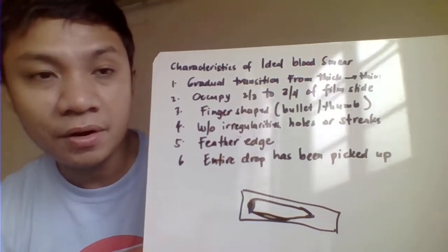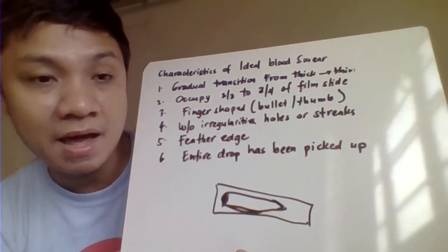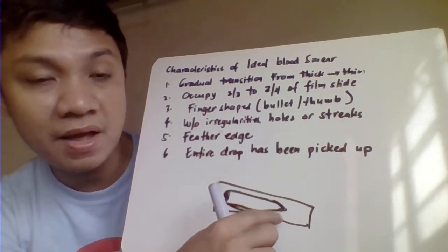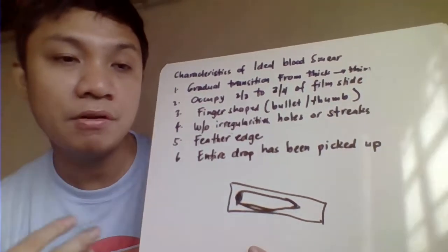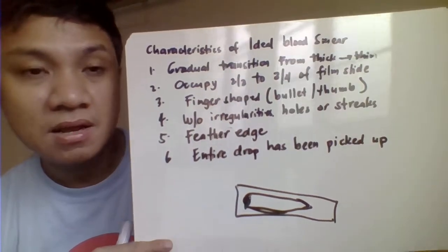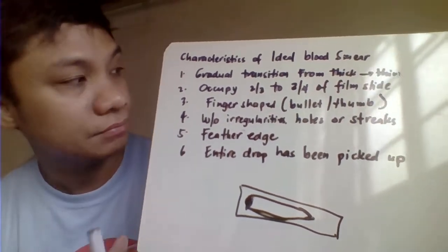When you are doing your differential count for identification of your different WBC, classifying them to different WBC, you start with the thin area in the feathery edge. So dapat may gradual transition from thick to thin. You start with a thin area in order for you to better scrutinize the morphology of your different cellular cells, in order for you to identify them correctly.